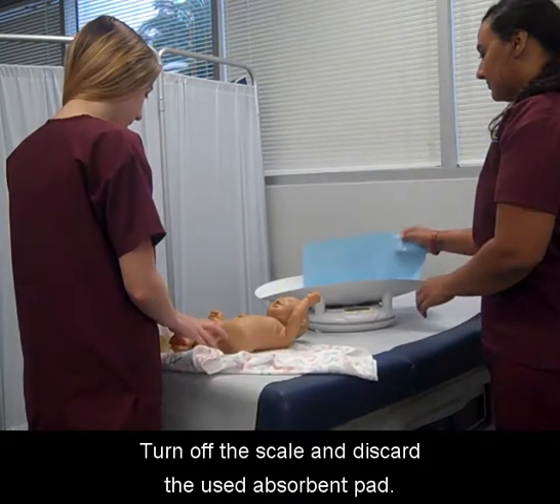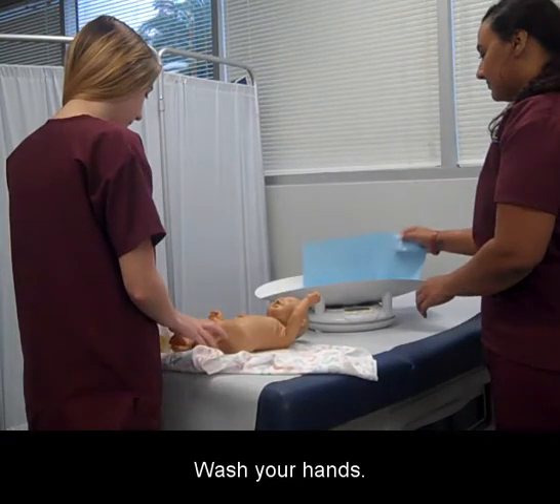Turn off the scale and discard the used absorbent pad. Wash your hands.